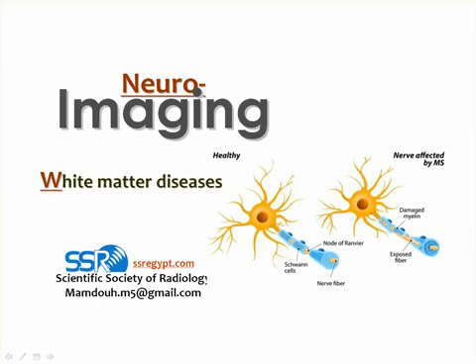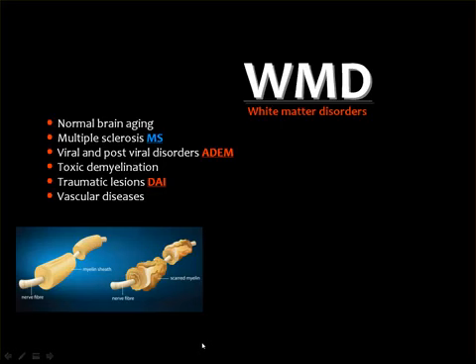We will discuss here, of course, the main lesion of the demyelinating diseases, which is MS, and we'll also show the differential diagnosis of this particular disease.